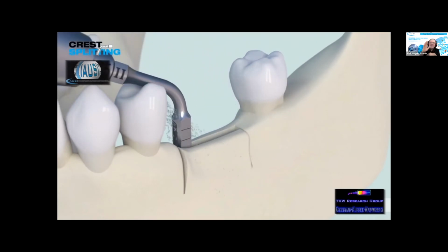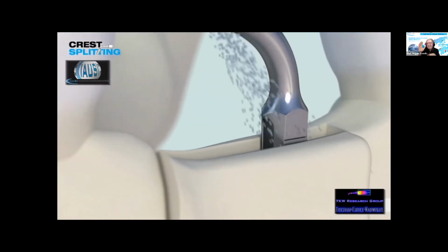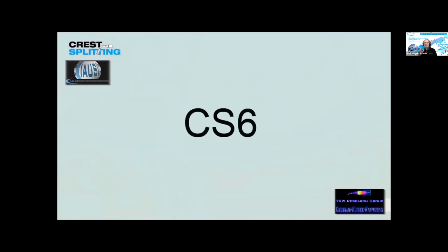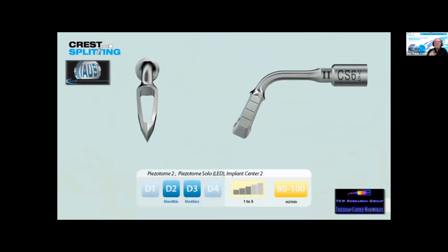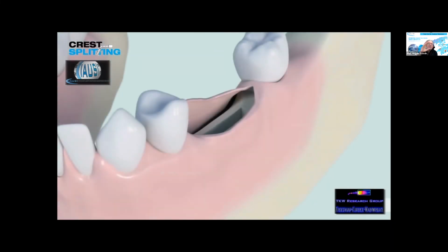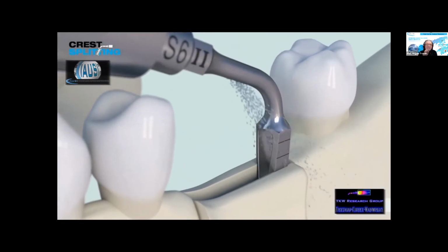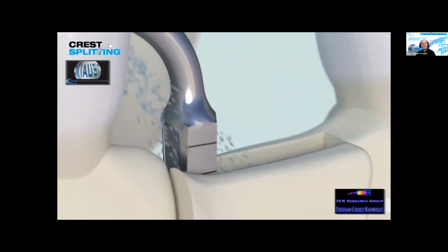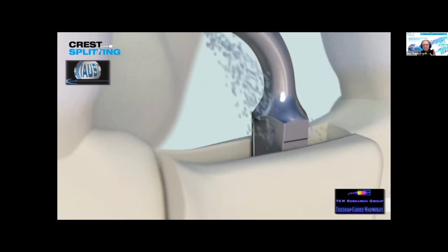I mean, actually, it's evidence-based, and by the clinical studies, it's about 1.5%, but that means 1 patient out of 100. And only in the extreme cases that you will be able to manage once you're very well trained with this method, because then you can split a 1 millimeter wide alveolar crest and widen it up to 5 millimeters. So step by step, we widen up the alveolar crest.